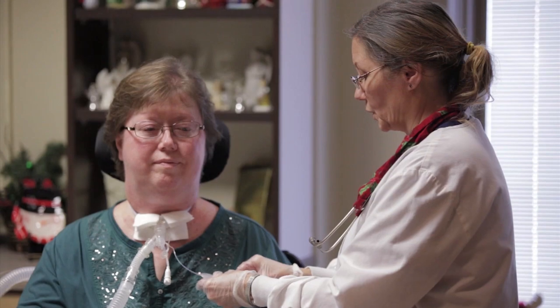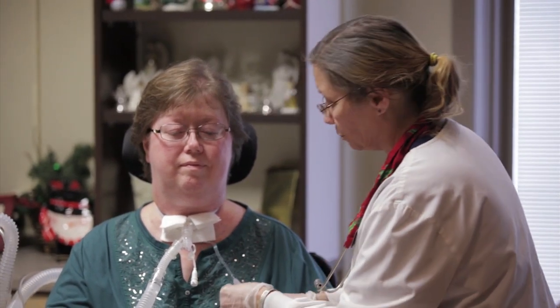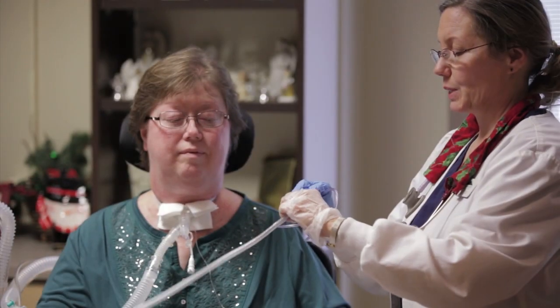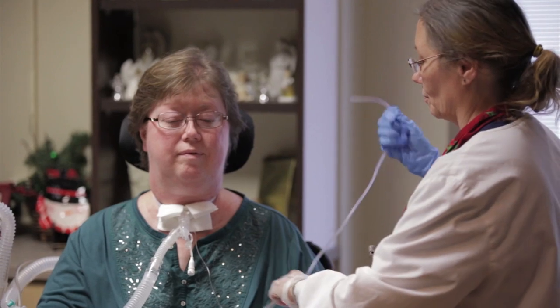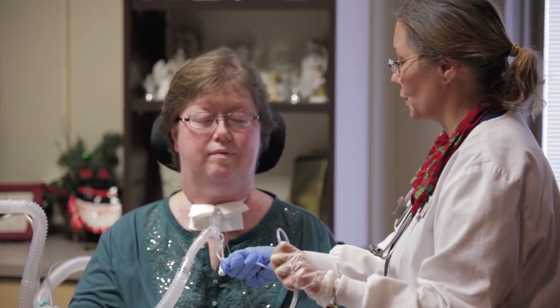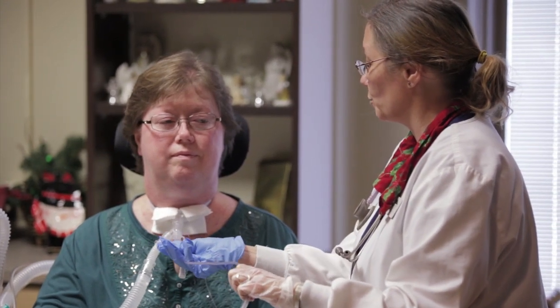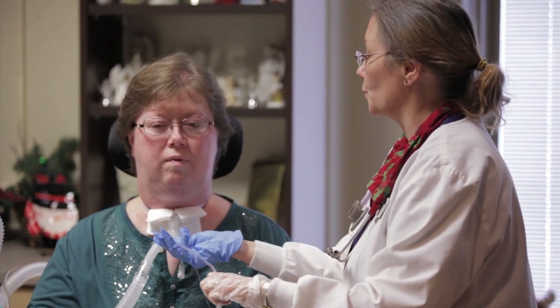I'm just going to attach this and have it set ready to go. I'm going to suction straight through your port as you requested. On a count of three, I'd like you to give good coughs. One, two, three.